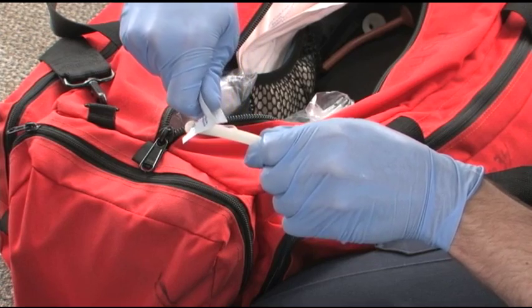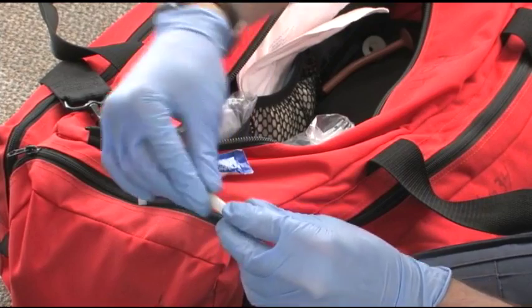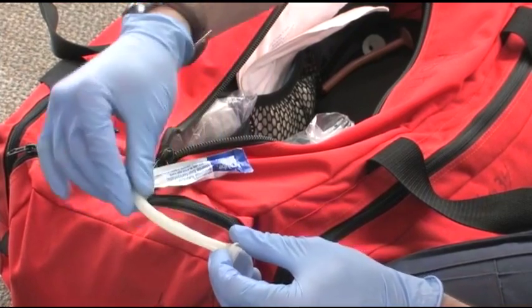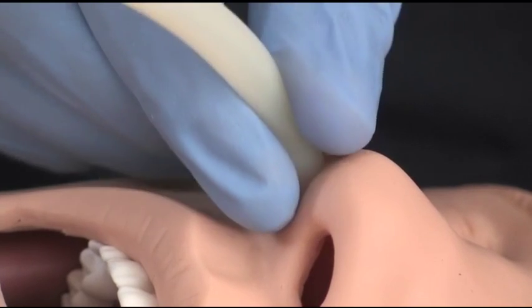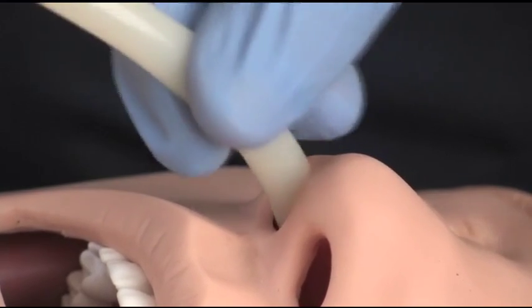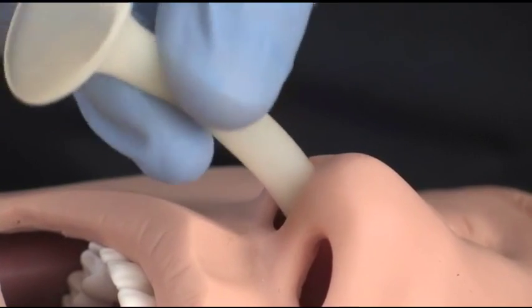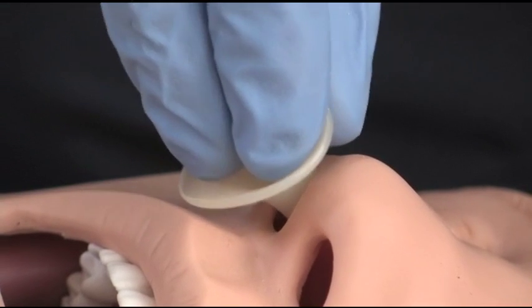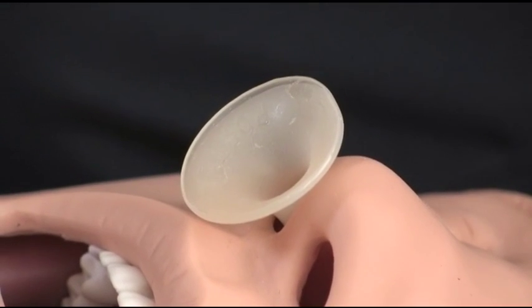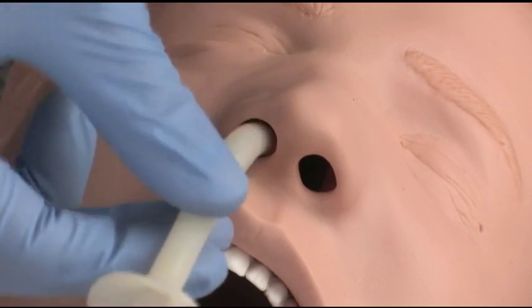Apply a water-soluble lubricant to the NPA before inserting. A training mannequin was used for the following steps of this procedure. Insert the airway with the bevel, the angled portion of the tip, pointing towards the septum, the wall that separates the nostrils. Slowly insert the airway into the nostril. By slightly rotating the airway from side to side, you may make insertion easier. At no time should you ever force the airway into the nostril.